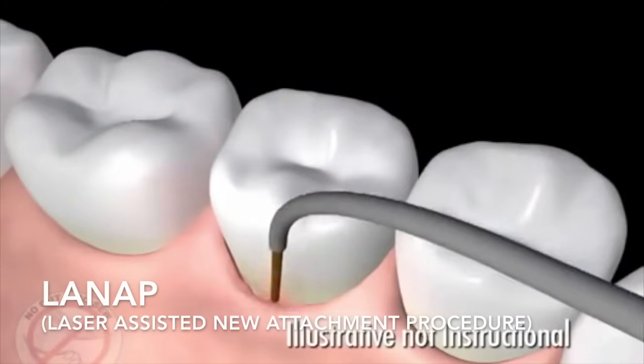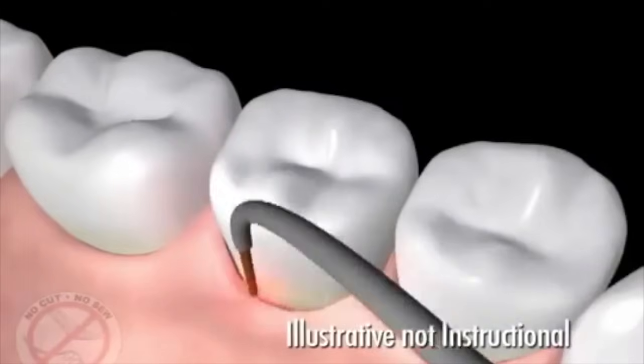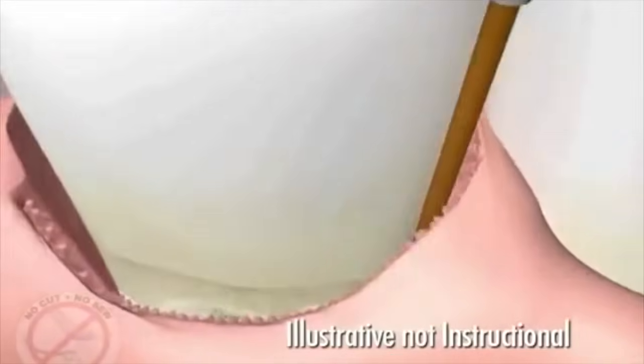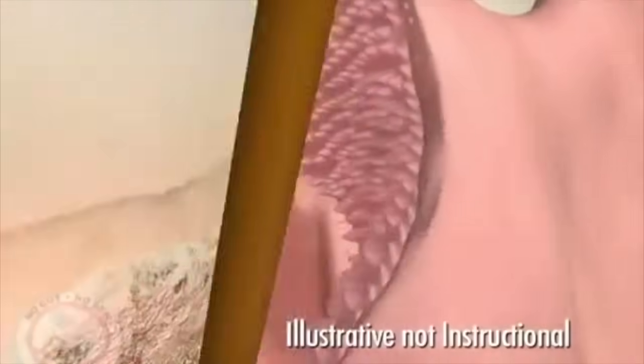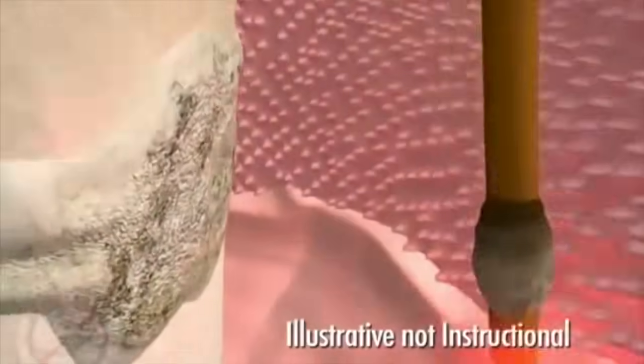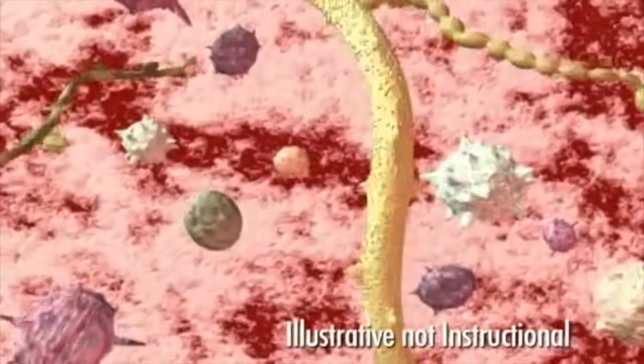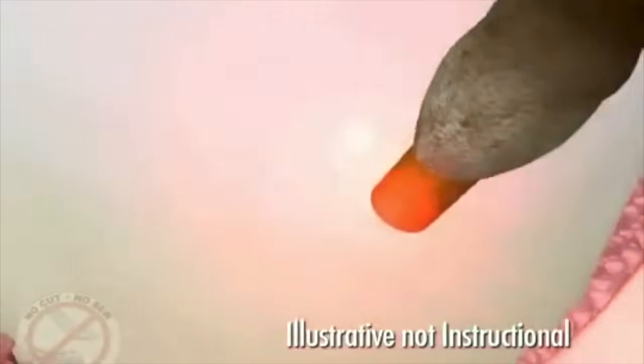The fiber optic tip is gently placed at the top of the periodontal pocket to begin removal of diseased tissue that lines the pocket. There are specific germs and bacteria that cause gum disease. The Periolase laser is designed to target and eliminate selectively only the diseased tissue and germs, leaving the healthy tissue unharmed.